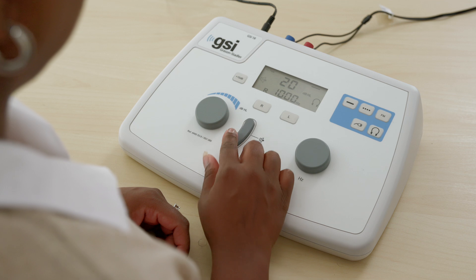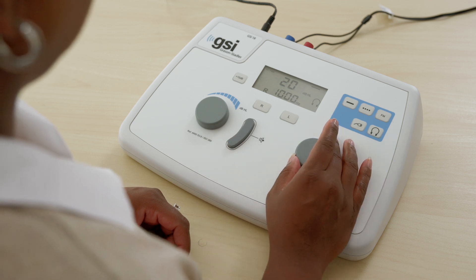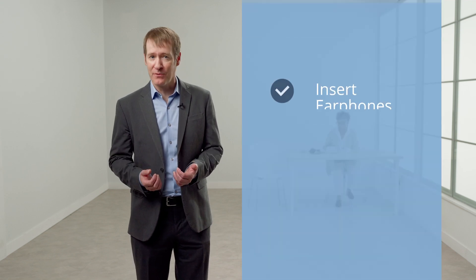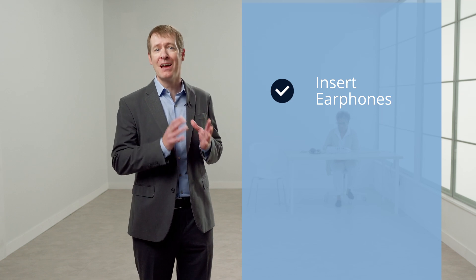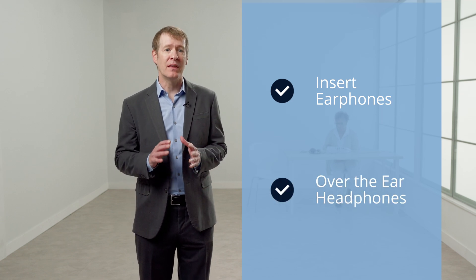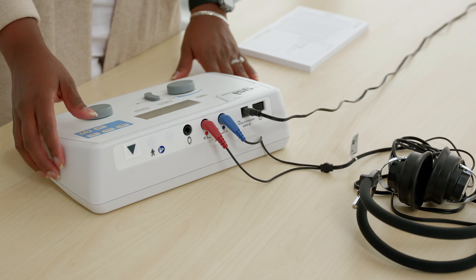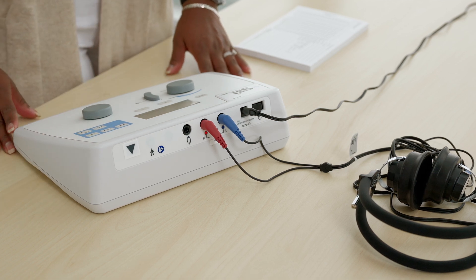The transducer selection will enable the proper calibration file for the selected transducer. The button with the picture of the insert phone will activate the insert earphone calibration, while the button with the picture of the headphones will activate the over-the-ear headphone calibration. The selected transducer will be indicated on the LED screen. There is one right ear and one left ear transducer port on the back of the instrument, so be sure to verify on the LED screen which transducer has been selected.